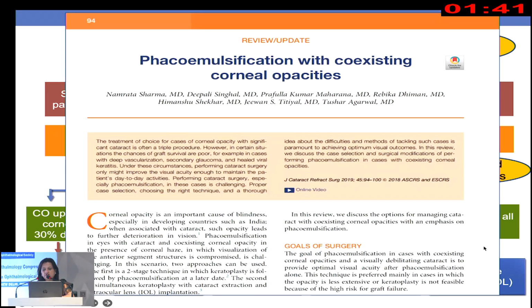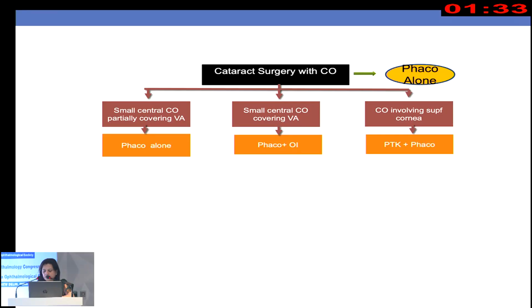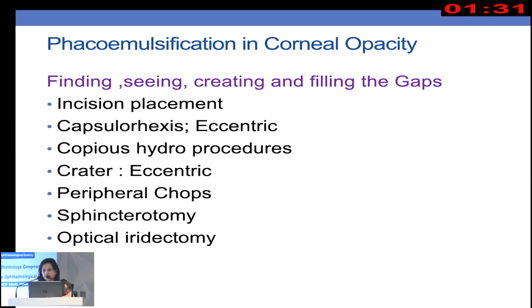So this is our review article which was published in the Journal of Cataract and Refractive Surgery on phaco with coexisting corneal opacities.